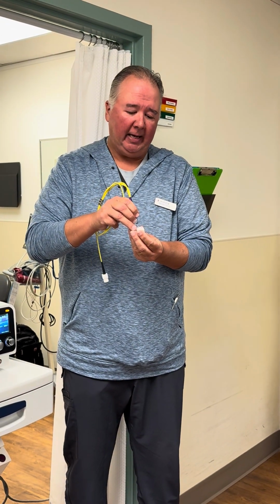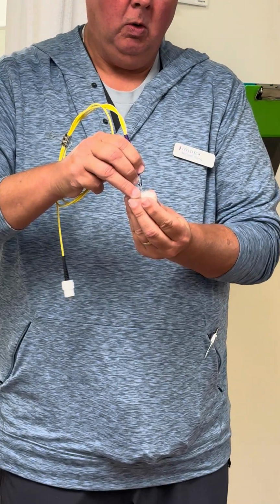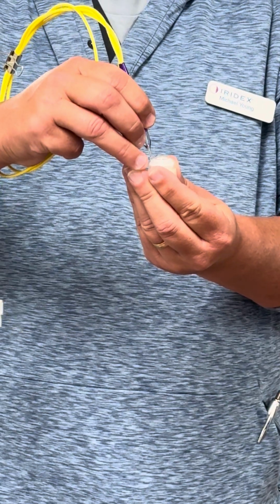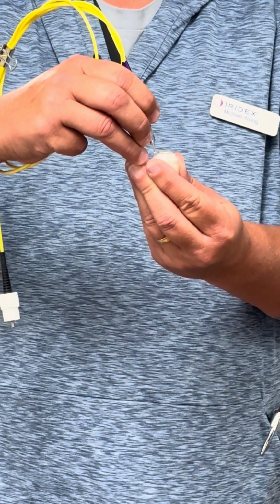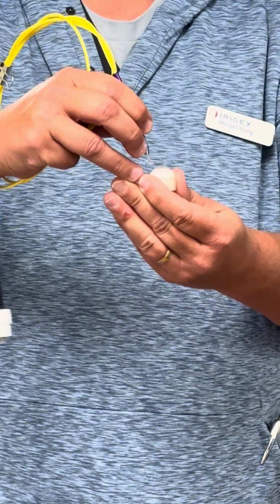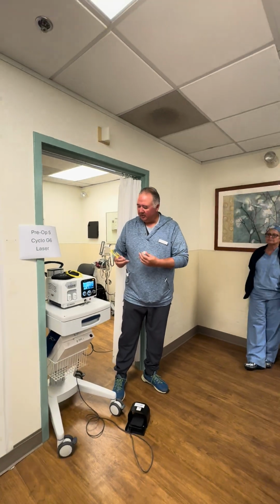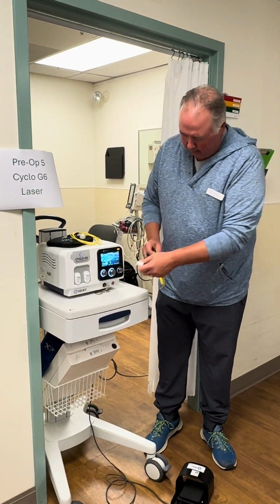So they're essentially taking 10 to 15 seconds to go from 12 to 3, and then it'll ding, and then they have to reverse. They do that 4 or 5 times. So that's the sweeping technology. So we'll hook this up in here.